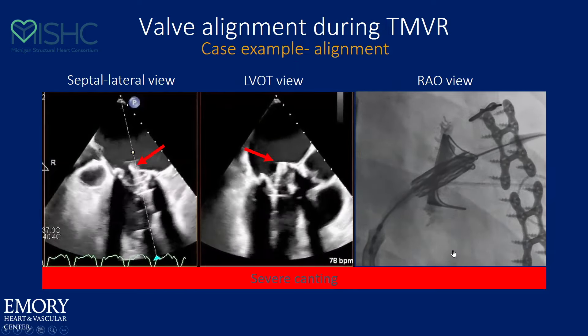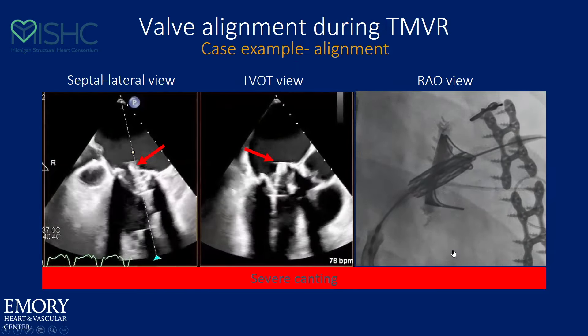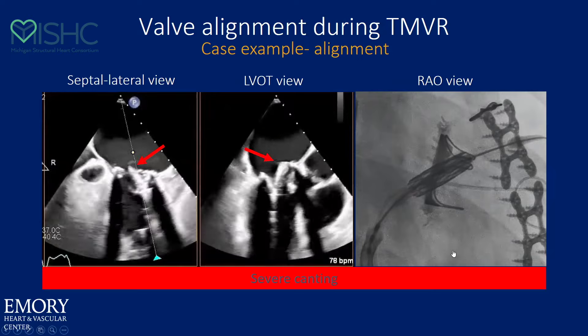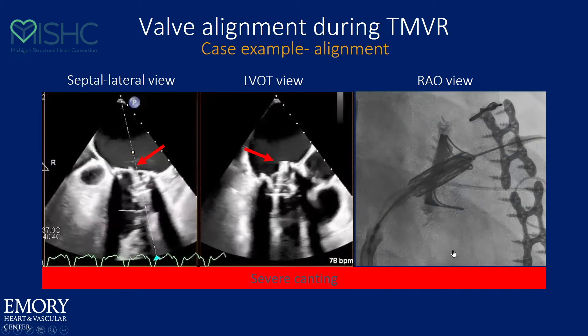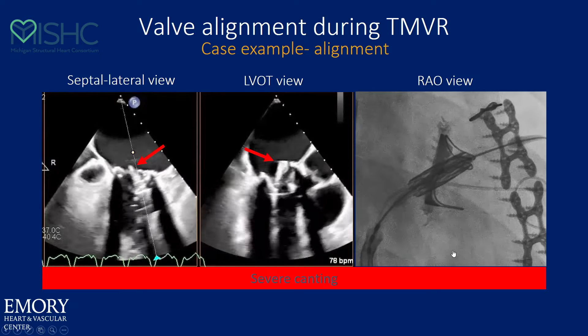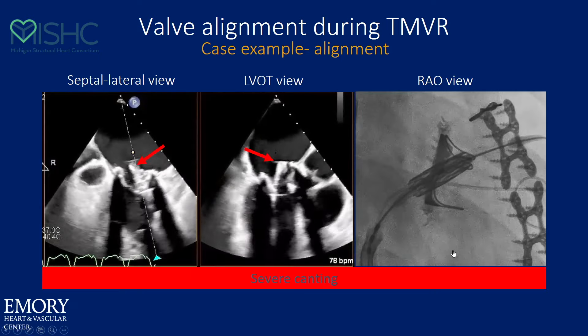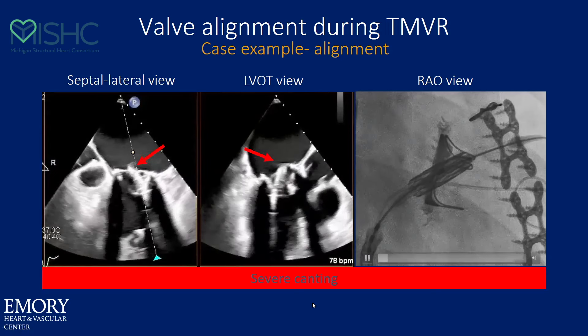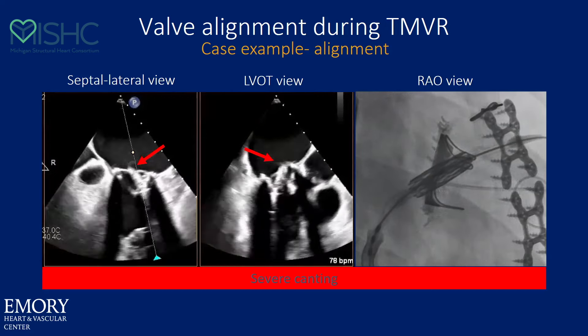If you look at that exact case and then deliver that valve, you can see how canted it wound up. In a valve-in-valve situation, the posts will help align it — it just makes it a little harder to determine your starting point. So in these cases, what I try to do is put the most ventricular portion of the valve at the end of the post, and then as I go up, slowly let the posts of the valve orient the transcatheter valve, and then maybe do a little push at the end.